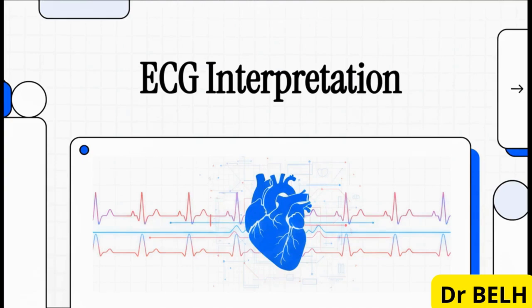Have you ever looked at an ECG and just felt your mind go blank? You see all those squiggly lines and a little bit of panic sets in, right? Well, what if I told you that in just the next few minutes, you're going to learn a simple, systematic method that turns all that chaos into a crystal clear conversation with the heart? This isn't just about getting a question right on a test. This is a skill that can literally save someone's life.